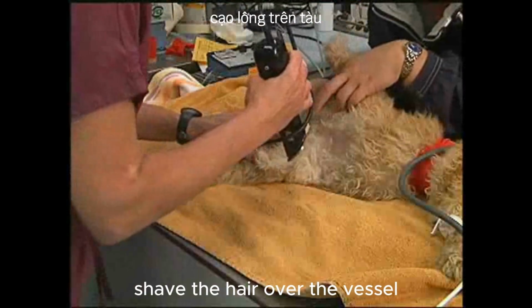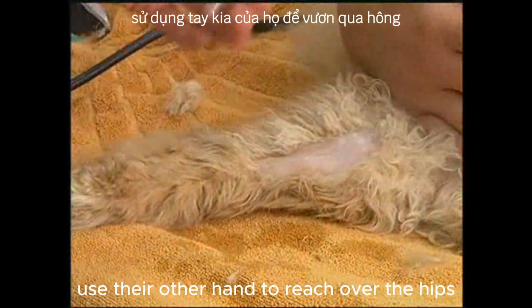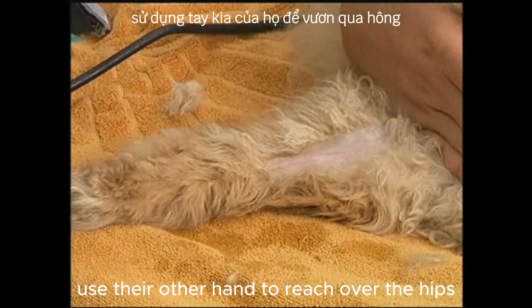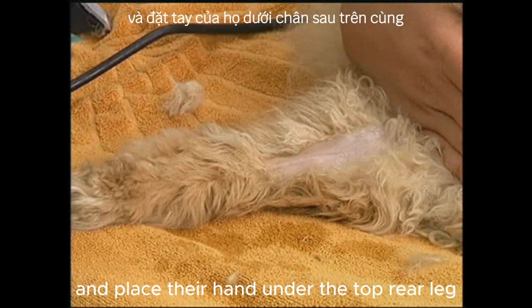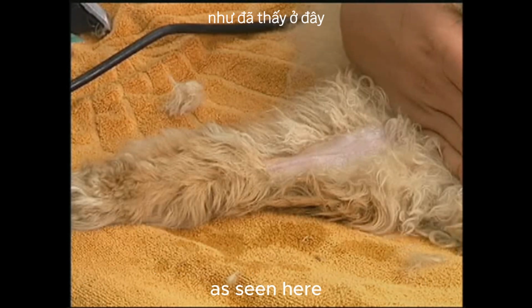Shave the hair over the vessel and use isopropyl alcohol on the skin over the femoral vein. Next, have the assistant use their other hand to reach over the hips and place their hand under the top rear leg to expose the inguinal area of the bottom rear leg as seen here.